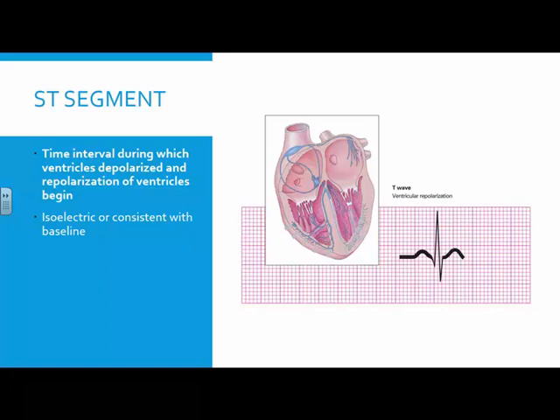Now, again, remember this. Your patients don't read the textbook. Sometimes none of this is going to even make sense. Sometimes you just have to chalk it up to what we call a FLB, a funky little beat, because we can't figure out what it is.